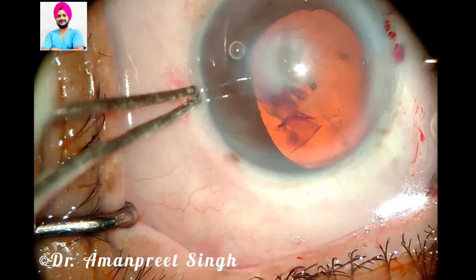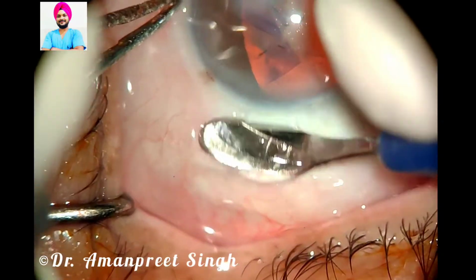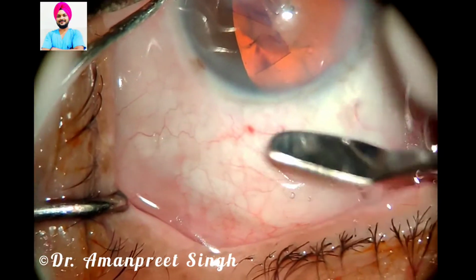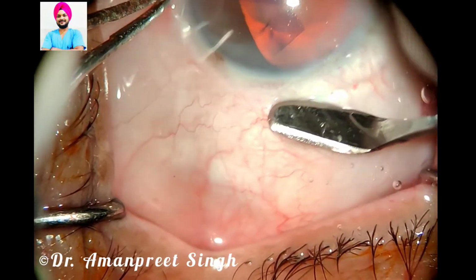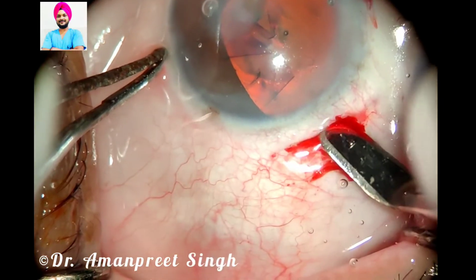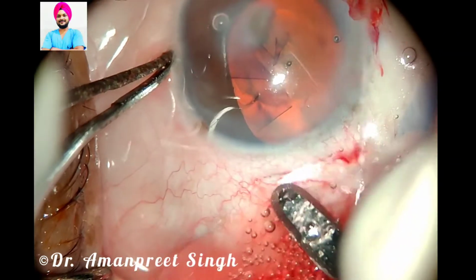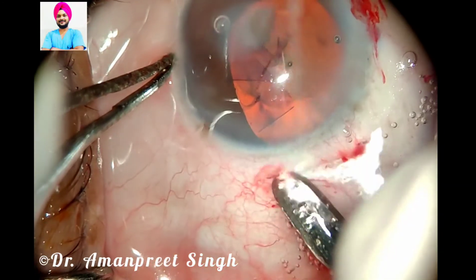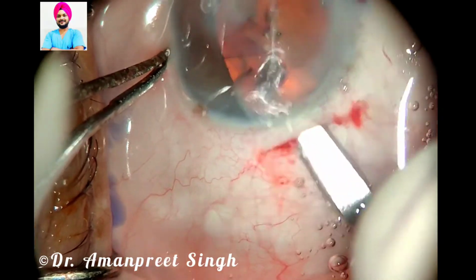Now it's time for the main incision. You can also give the main incision beforehand, before doing the rexis and all, but I prefer to maintain the anterior chamber with the viscoelastic and then form the tunnel. So with the help of crescent blade I have given a straight incision and I am finding the correct depth of the tunnel to make, and with the help of crescent I have found a good depth.